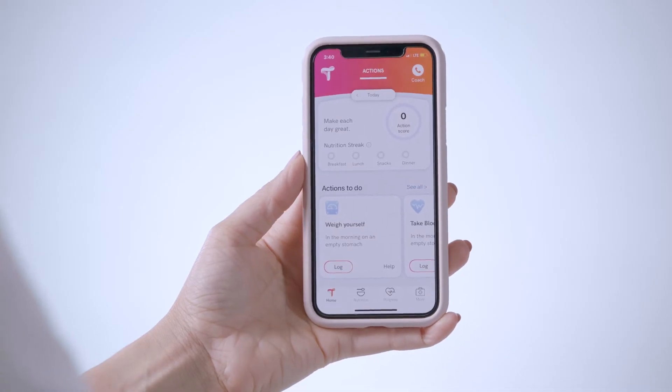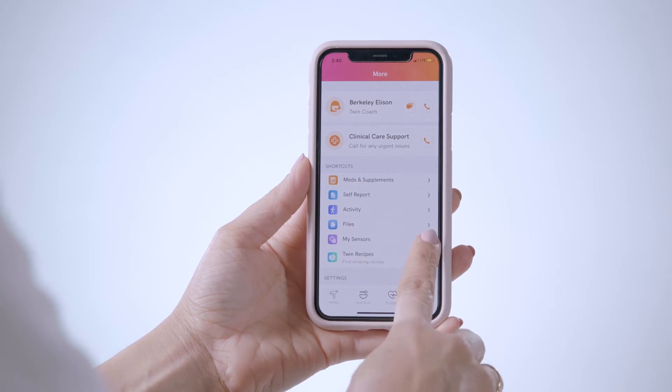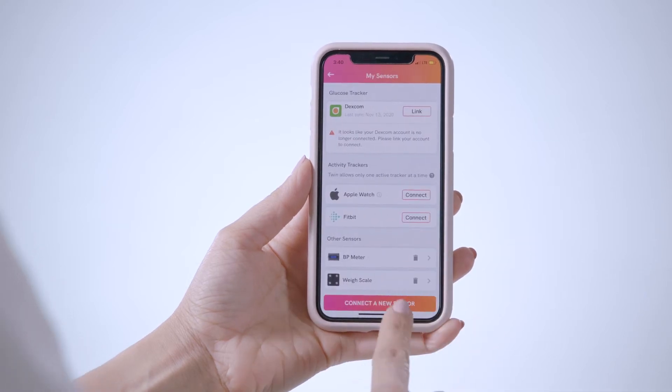Have an alcohol wipe ready to go. Now let's talk about what you will do with your coach when you set up your ketone meter together. If you haven't already, you will put the two batteries in the ketone meter. Next, you will sync the ketone meter to the Twin app by opening the app and going to More, My Sensors, and then Connect a New Sensor.